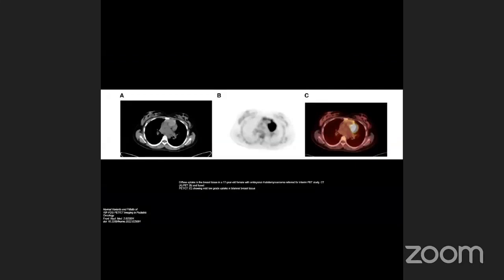Okay, let's come back to some challenges while you read the PET-CT and PET-MRI. So when you go, for example, to this lesion, you find that in CT you can barely detect that there is something here, maybe. But if you go to the PET, there is again something tricky: there is activity within the heart, as we mentioned before, that there is normal physiological uptake, right? So what is going on here? There is another lesion here.